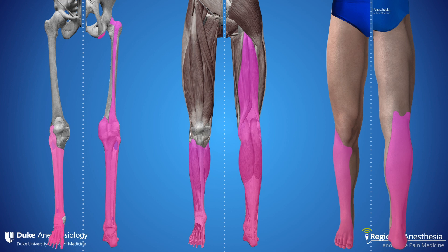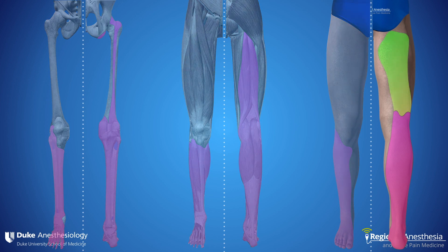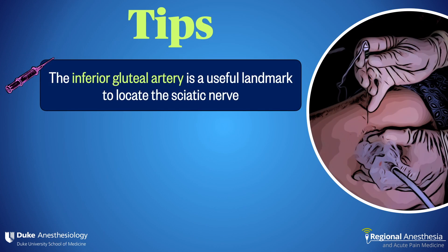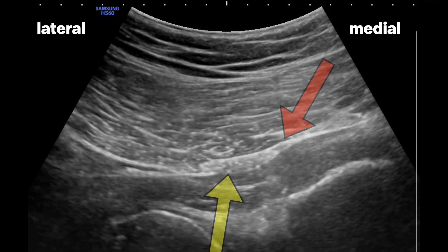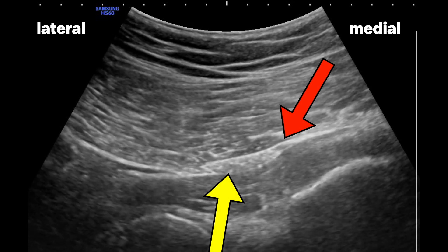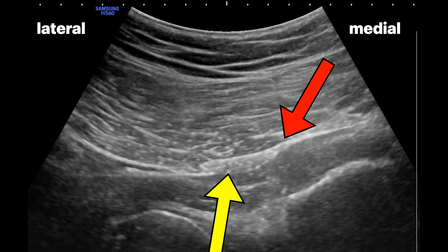Catheters work well here too, as muscle tends to hold them in place. Note that a block of the posterior cutaneous nerve of the thigh can occur but it's not guaranteed. Here are some tips for the subgluteal sciatic nerve block. First, when you're trying to decide between hyperechoic smudge A and hyperechoic smudge B, the inferior gluteal artery can be a useful landmark to ensure that you're at least aiming for the right plane. Here we see the nerve and the artery side by side, as is often the case.